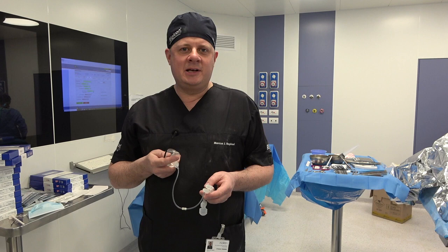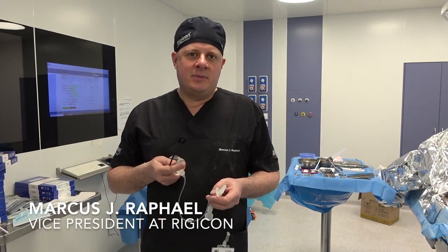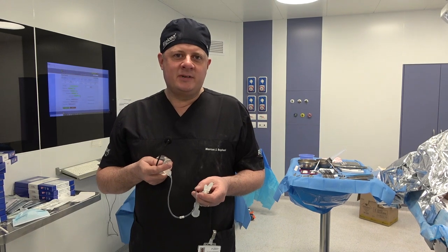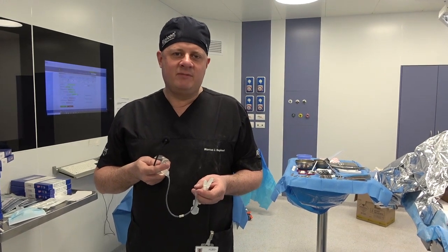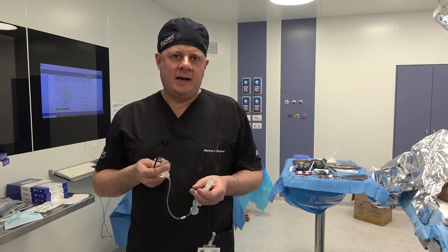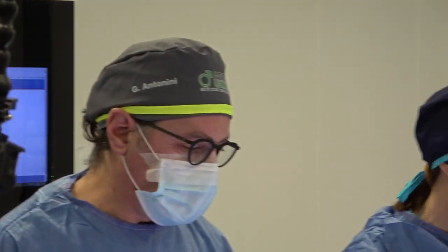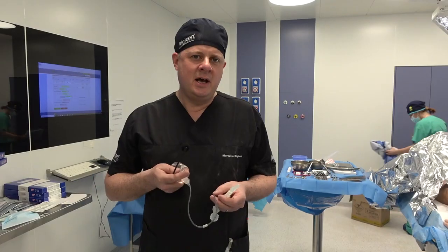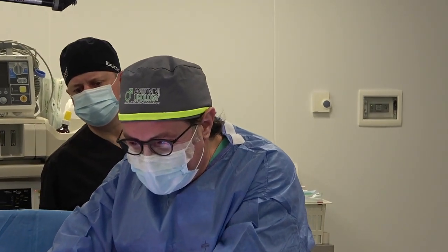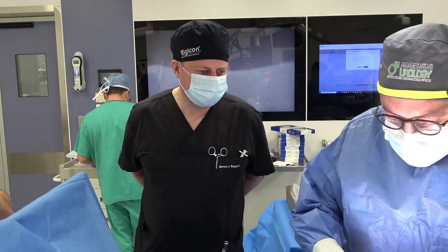Good morning. We're live from Rome. I had the pleasure of working with Professor Antonini this morning where we've conducted an Infla 10, 22 cm on a patient with a relatively straightforward history. Very interesting to see Professor Antonini's approach by making a very, very small incision for the infrapubic approach.